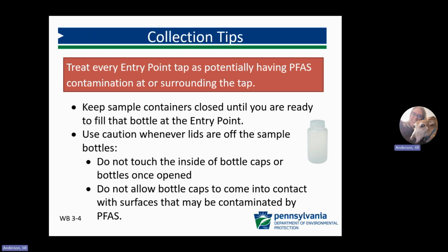Use caution whenever you remove the sample bottle lids. Protect the sample bottle integrity by not touching the inside of the bottle caps or bottles once opened, and do not allow bottle caps to come into contact with surfaces that may be contaminated by PFAS. While filling sample bottles, if you think you may have inadvertently touched something at or near the sample tap that could potentially have been contaminated with PFAS, replace your gloves with clean nitrile gloves.